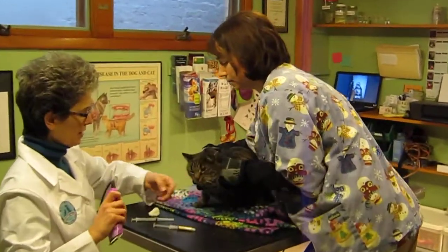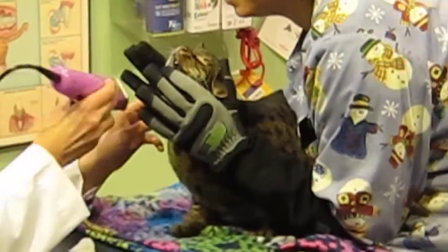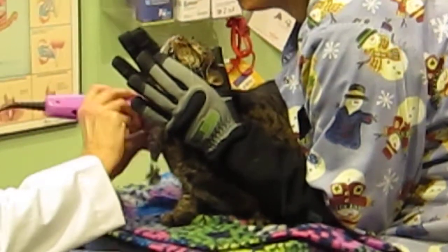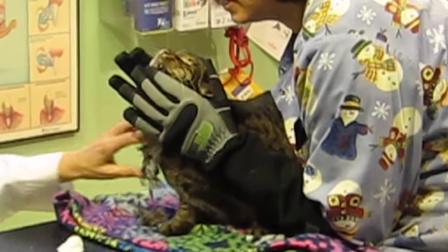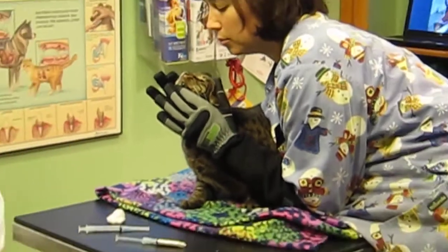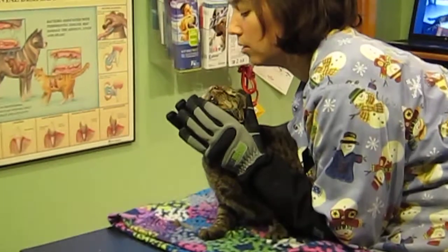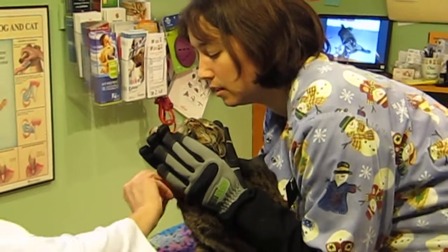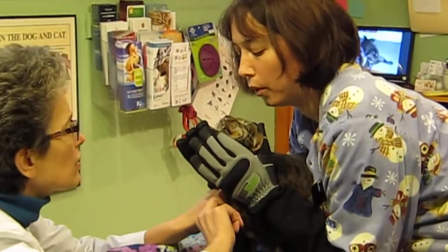I'm going to go ahead and elevate his little head. Good boy. Quieter clippers. You can see she's just elevating his chin and neck, and while she does have good control of the head, there's going to be a chance one of her fingers slips and Mr. Ranger's little teeth are right there.